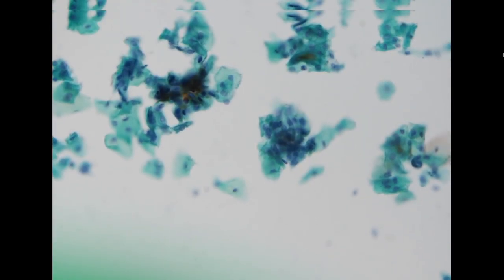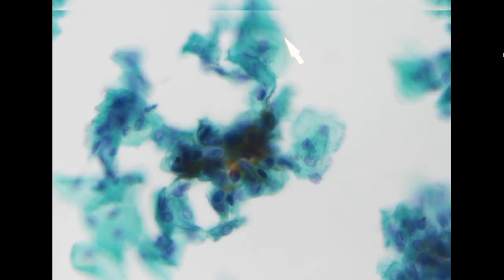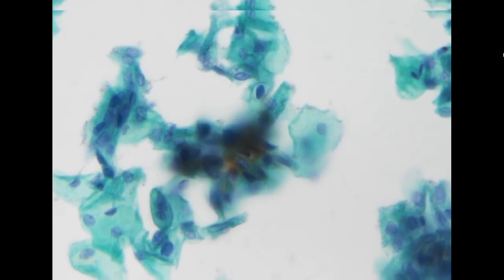When we go to higher power, we can appreciate that we do have some cells with slightly increased NC ratio and slightly darker staining of the nucleus. The size of the nucleus is not particularly increased, and there are some very vague halos over here, a vague koilocytic feature, such as this here.